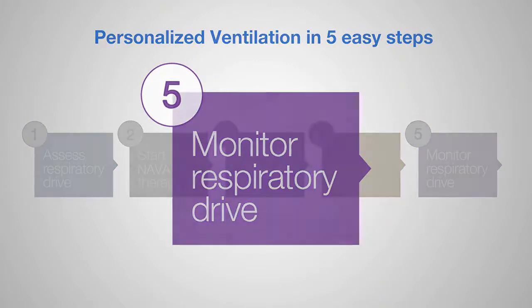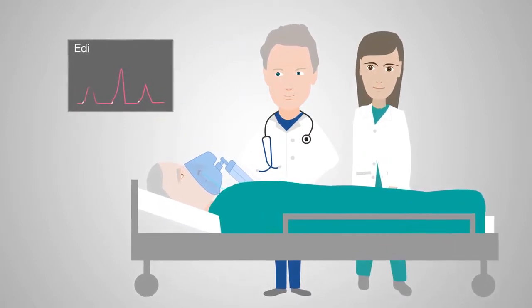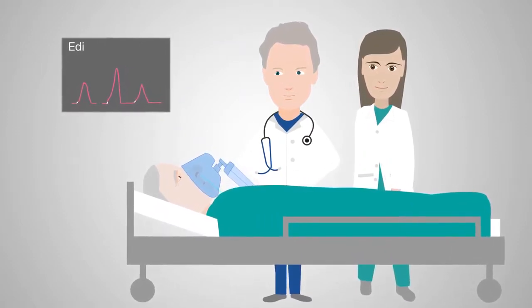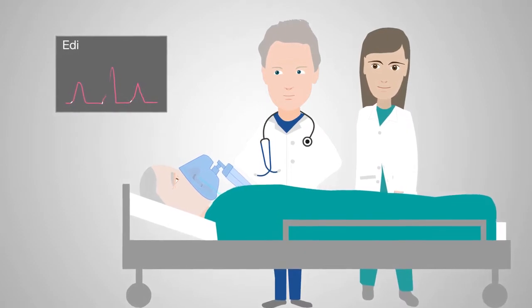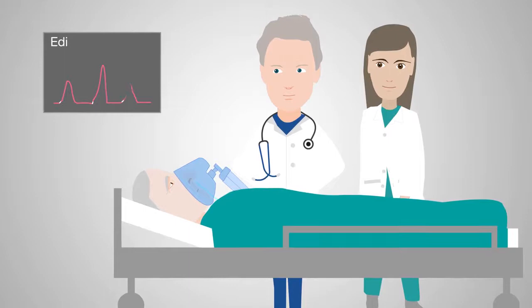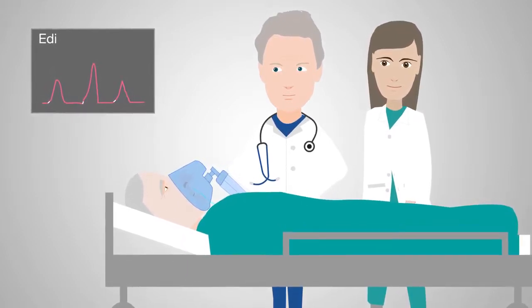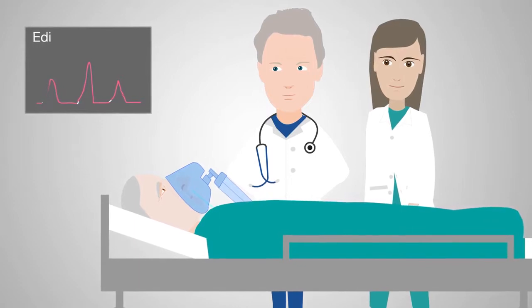I keep an eye on the awake patient and the EDI to decide when to free the patient from the ventilator. To make sure his breathing is fine, I continue to monitor the EDI. Should the EDI rise, this is an early warning indication of increased patient effort.